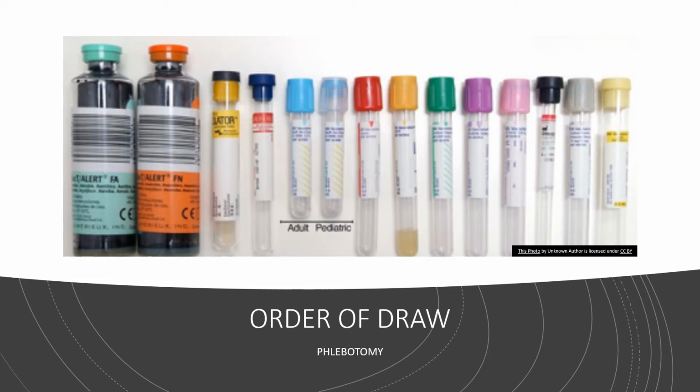That serum separator tube can be called a tiger top tube because a lot of times it may be black and red. This particular one, if you were able to look down on that tube into the center, it would be red, and so you have the gold and the red, or a black and red. There's different names for it, and we'll go through it. But the dead giveaway that this is a serum separator tube, which is drawn after your red top tube, is the fact that it has that gel down in the bottom of it.